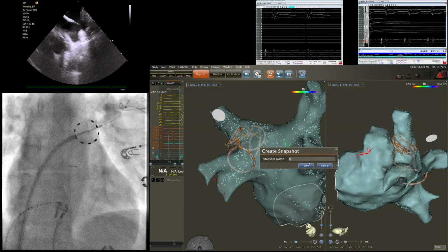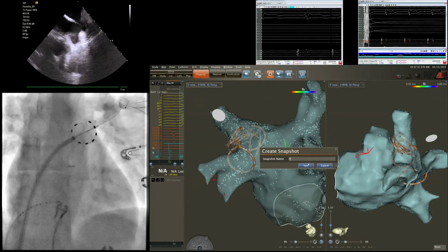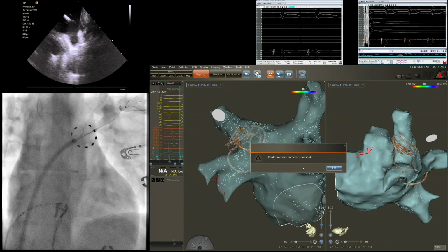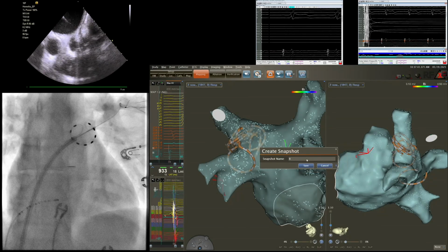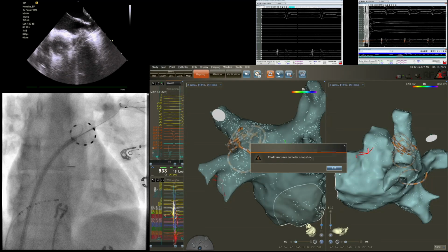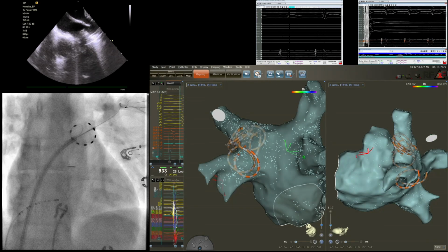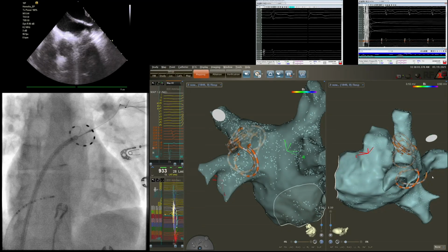Peter, what's the experience of the operators with this technology? What do you mean about experience? How many cases? This is my third case, okay? Wow, so a live learning curve. 1, 2, 3, okay? Because Peppo asked me to replace Atul, and Vivek is in a different room, and he's doing more cases. I think he did excellent some cases.